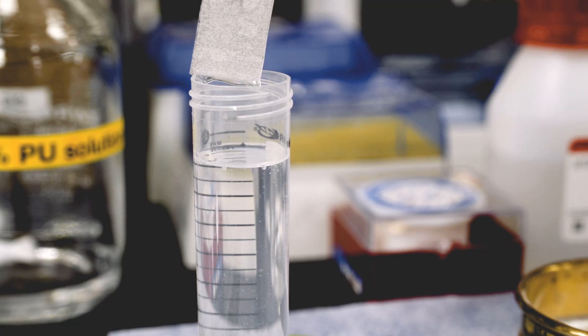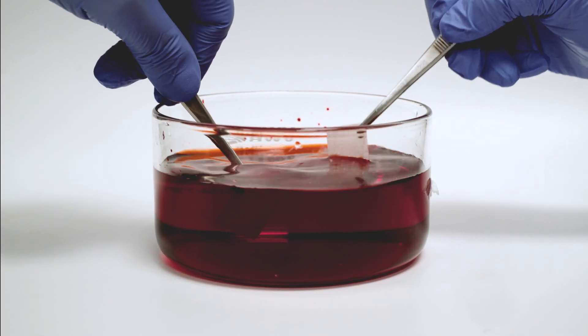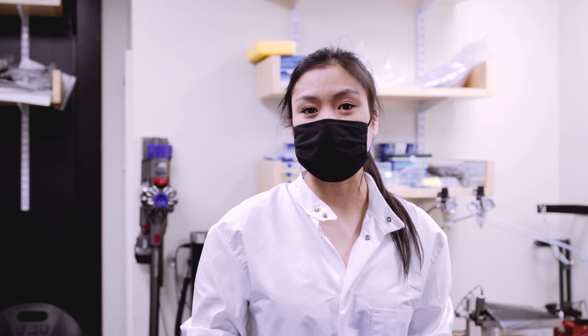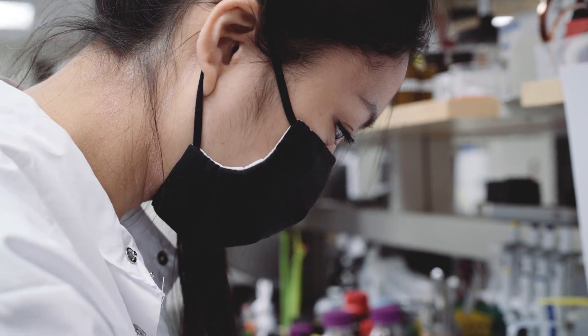This fluid-infused matrix helps prevent the bioadhesive material from becoming contaminated by body fluids as it is navigated through the body. Meanwhile, a non-adhesive anti-fouling layer on the opposite side prevents the patch from being contaminated by bacteria or other foulants that can cause inflammation.